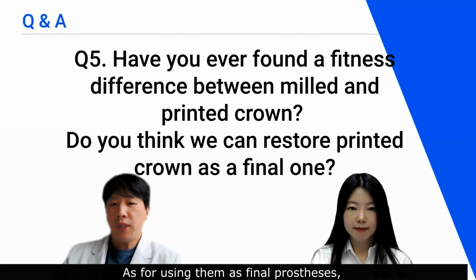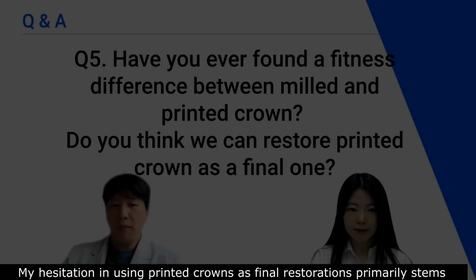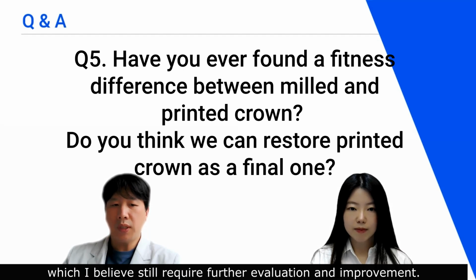As for using them as final prostheses, the precision and fit of the output are generally not the issues. My hesitation in using printed crowns as final restorations primarily stems from concern about their strength and adhesion properties, which I believe still require further evaluation and improvement.